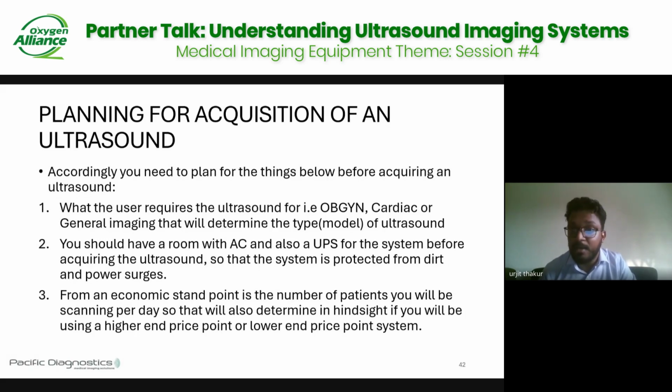It can be that. Suppose your customer is a cardiac specialist. He would need a high-end machine where he needs to do cardiac scans. He would need the Dopplers, the power Doppler. He would need to know how his patient's heart is. So for those customers, you could suggest a higher-end machine. The important thing is you need to know what your customer requires before you can supply him with a quotation on what system he needs.